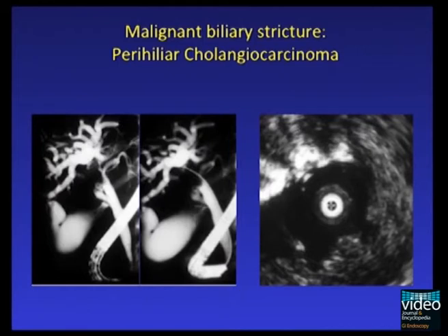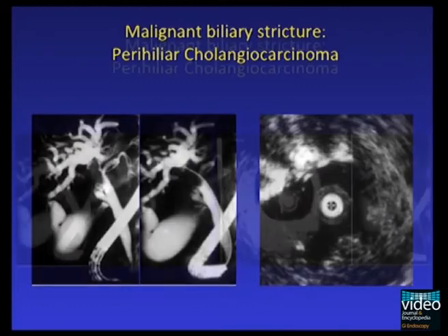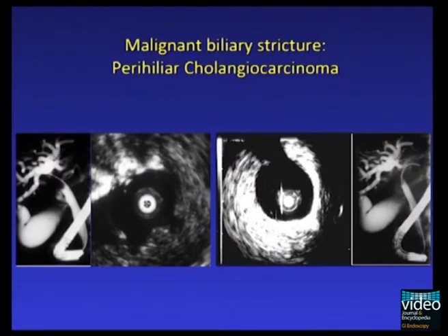Additionally, intraductal ultrasound may allow a reliable statement with respect to resectability. In a patient referred with suspected perihilar cholangiocarcinoma, fluoroscopy suggested a type 3 to 4 tumor according to the Bismuth classification, with a large filling defect. After insertion of the mini-probe past the stricture, the echo-poor mass shows infiltration of a malignant tumor in the right intrahepatic biliary system. The probe is then forwarded into the left hepatic duct and slowly withdrawn. After reaching the bifurcation, the endoscopist clearly determines that both the left hepatic duct and bifurcation are free of tumorous infiltration.